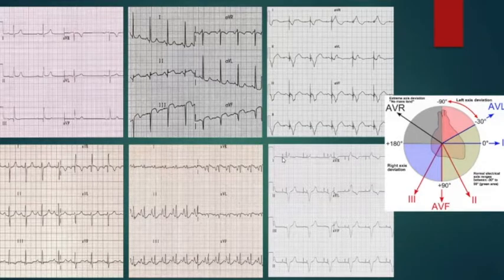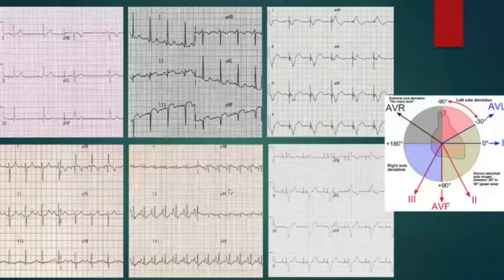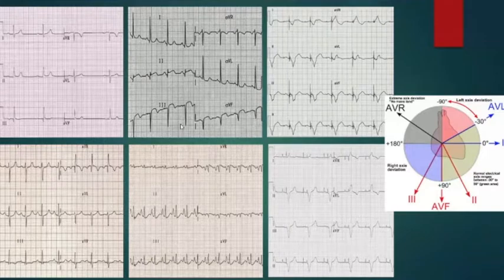So you have a small line here, which is a spike, the stimulation of the atria, usually the right atrium. Then you have this spike, which is stimulation of the ventricle, and then you have the QRS complex. When I asked you how many types of pacemakers there are, DDD means dual chamber. The chambers you are using are right chambers, because they are low pressure chambers. If you put something in the arteries, you'll have constant bleeding and the patient will die from anemia. But in right chambers, you can put something that exits the blood vessel and you won't have more bleeding than usual, and it's only in the procedure, no more.